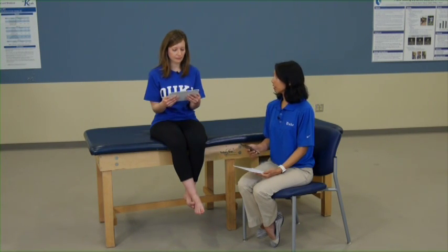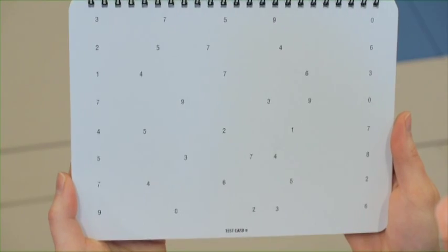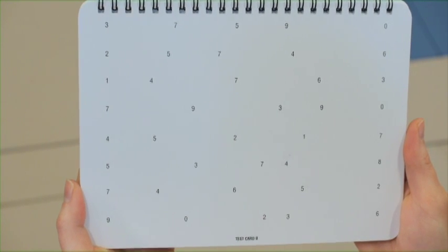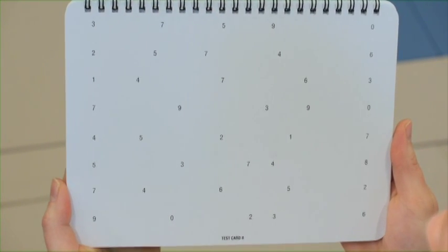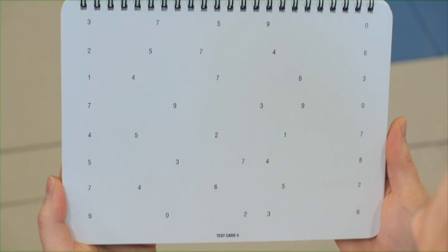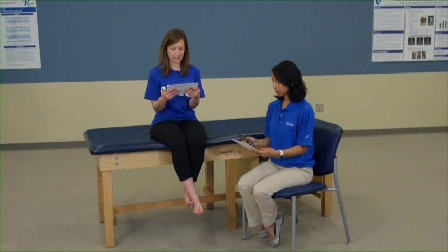Now she will turn to test card two. This one does not have lines for her to follow along with, so it's a little bit more challenging. When you're ready, go ahead. [Patient reads test card 2.] Good. How do you feel? Good.